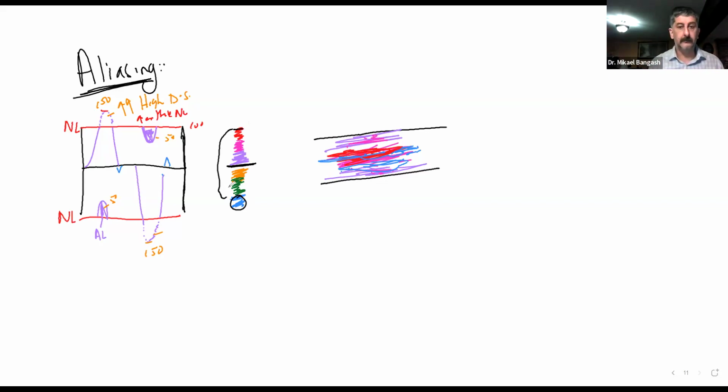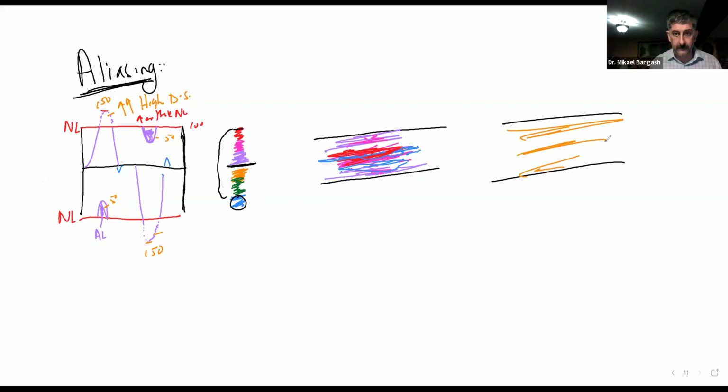Did you guys get that? Yeah. Good. Or if you, on the other hand, say that we had a blood vessel, but primarily some negative Doppler shifts.